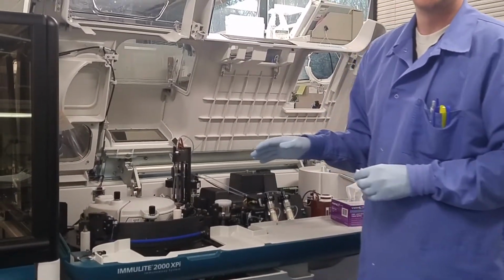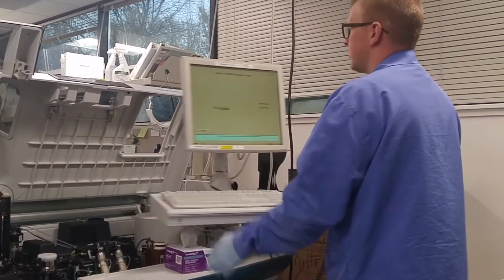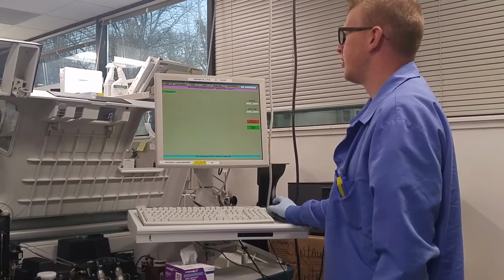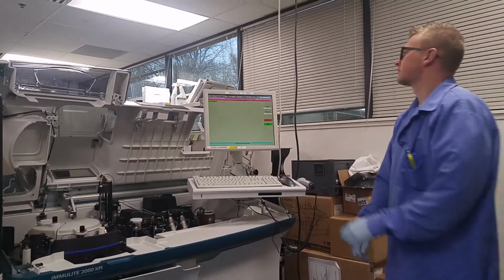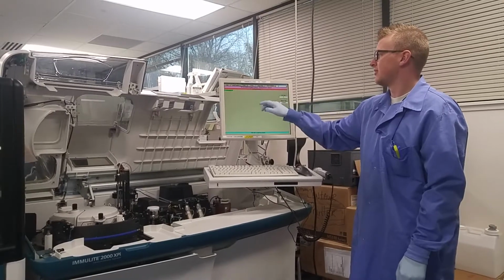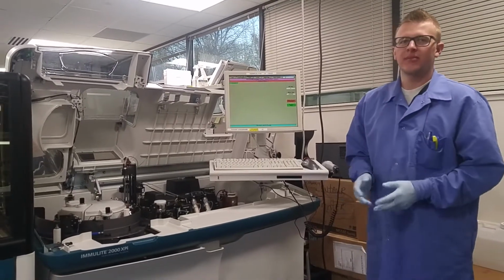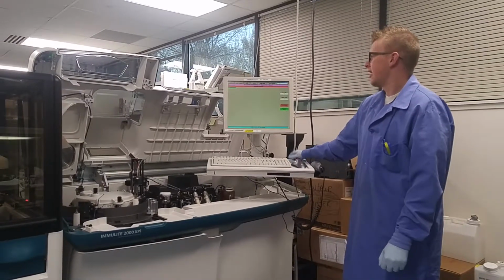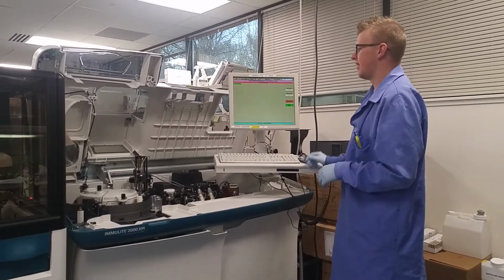Next what we're going to do is home all of the motors in the system so they go back to their default ready setting. So you're going to go here and click Condensed Run Program. You will hit Home All Motors and then Run. This message here says initializing ramp tables. It will switch to homing all motors. Once the process is done, it will say program complete, and then we'll go on to the next step. So now the message is switched to homing completed, so we know that our test system is back to its default ready setting, and everything is aligned.